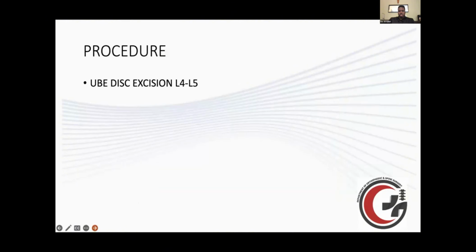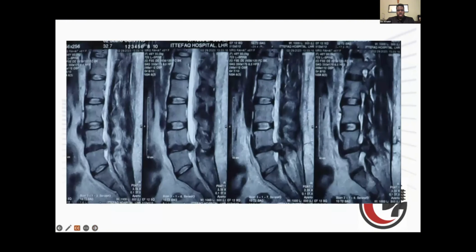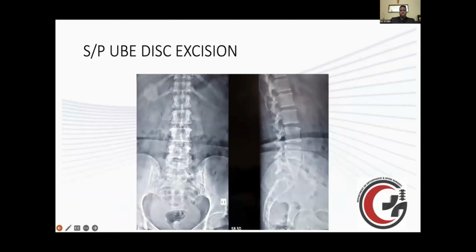A question for Dr. Umair or Dr. Rizwan: pre-op, before the first MIS disc excision, do you get flexion extension films? Was there any sign of instability? And if you do recognize that somebody has a sacralized lumbar vertebra, is that a relative contraindication for you to do endoscopy or any endoscopic techniques versus a more open procedure?